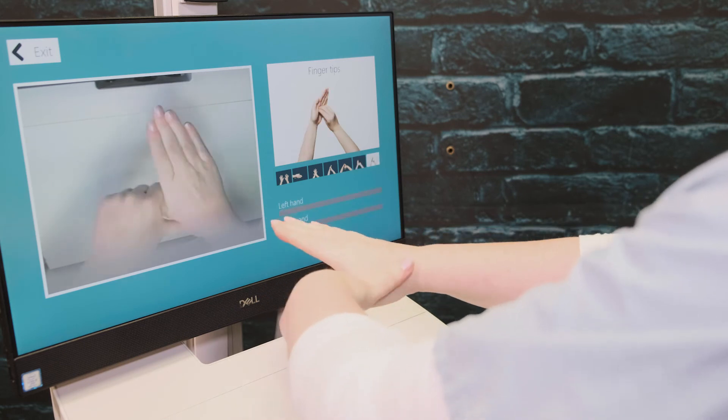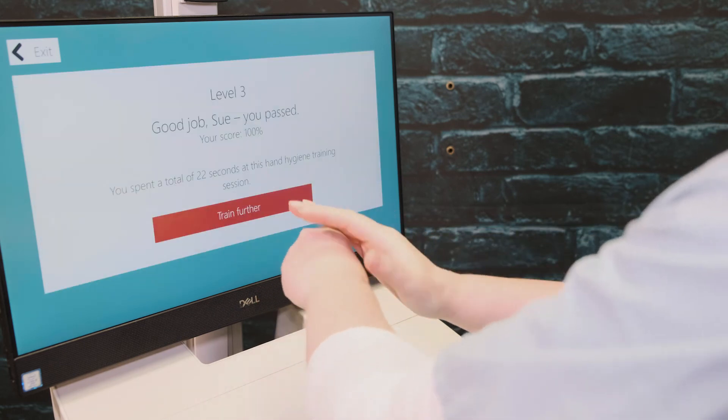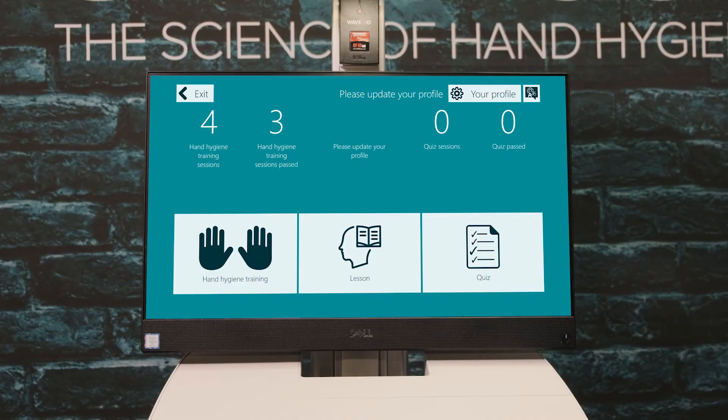Once you complete all the poses, the score screen will tell you how you did and it will highlight any poses that you had difficulty with. Return to the main menu, where you can choose to do another hand hygiene training session, a quiz, or a lesson. Not all functionalities may be available on your system.